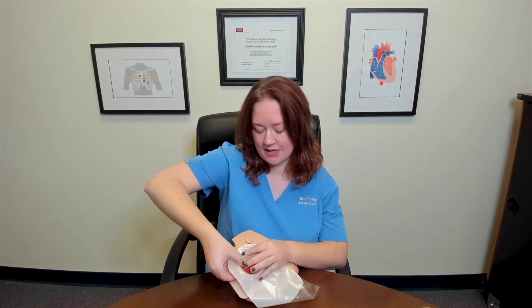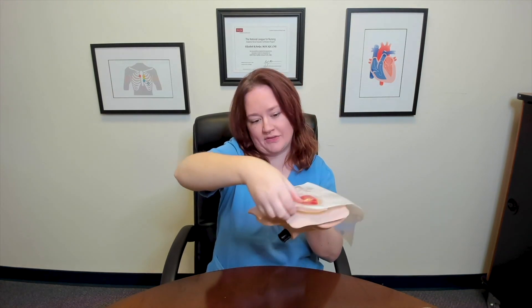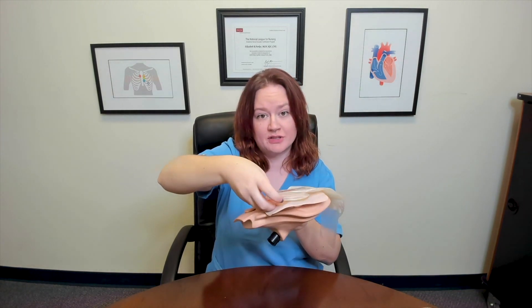So I'll align my rings and then I simply pinch around the ring. At no point do I have to apply pressure onto the patient's abdomen. And that can really make your patient much more comfortable and prevent a lot of pain and discomfort.